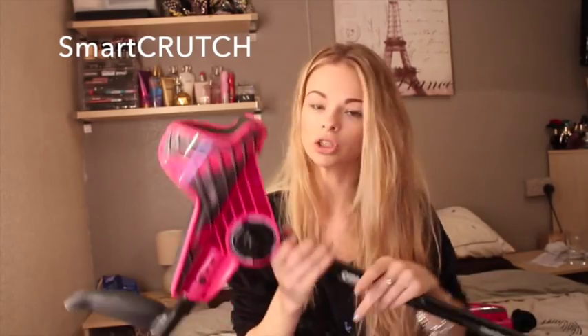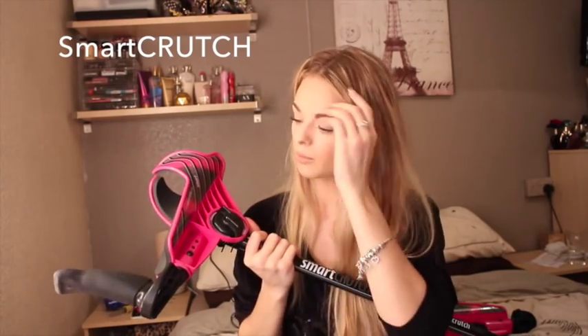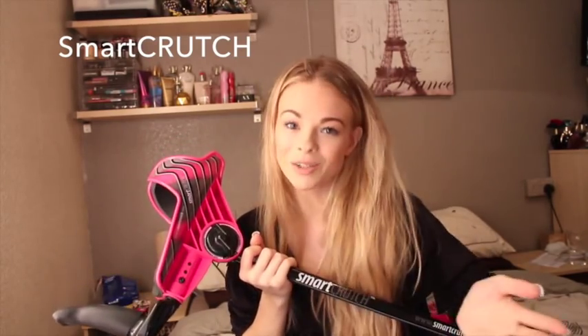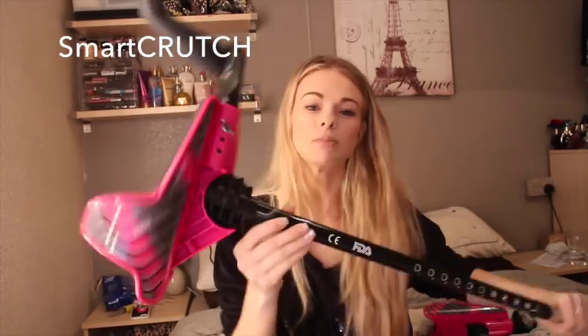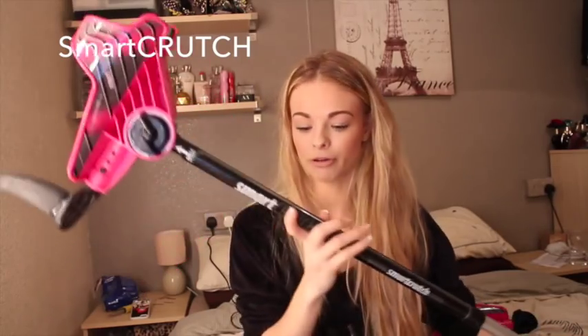I just think it is fabulous. Obviously, you get to pick your colour — and of course, what other colour would I have picked other than pink? Though it doesn't always go with every outfit. But it's my walking aid, so that's my excuse — I don't care whether it goes with the colour of my outfit or not. But you can pick lots and lots of different colours.